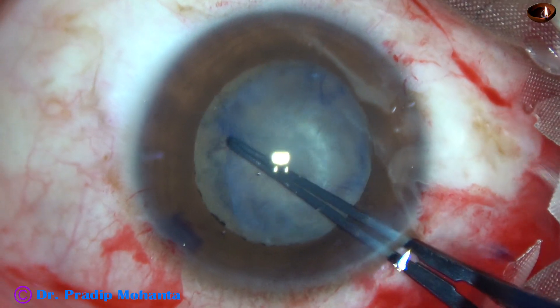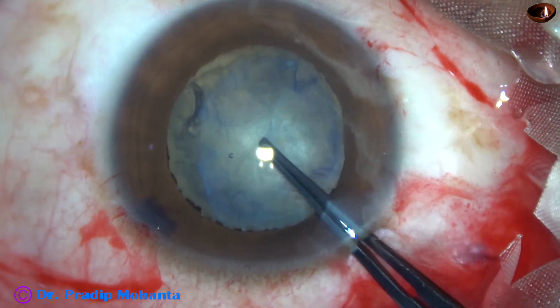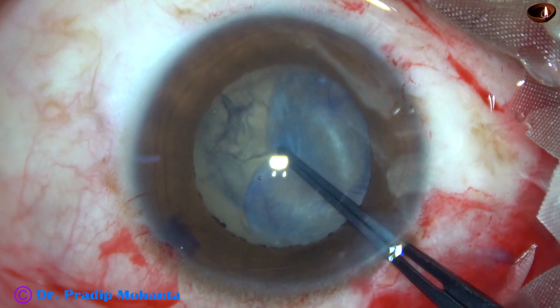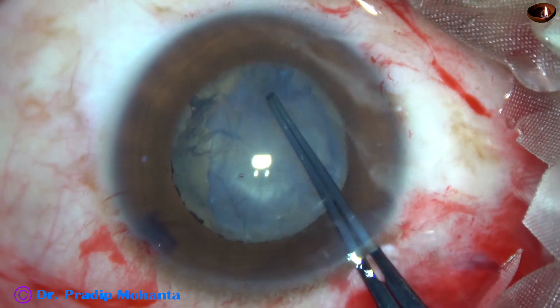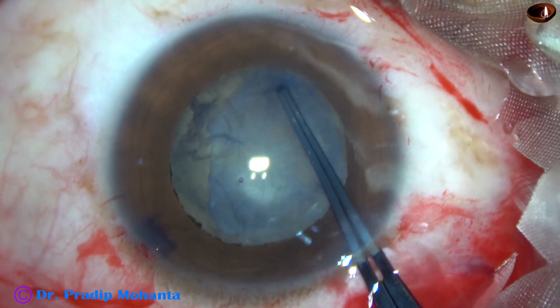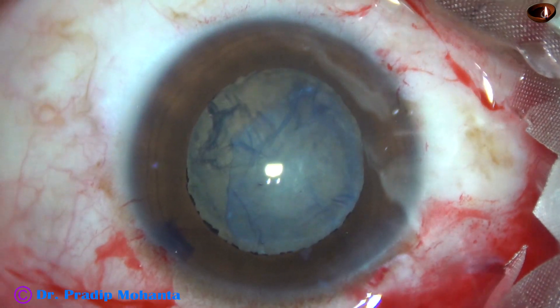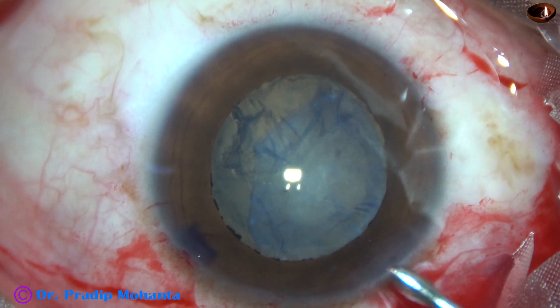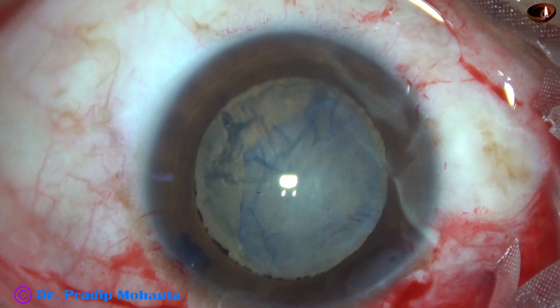Here I could go beyond the edge and bring it here, and again dissecting the anterior capsule from the fibrous sheet. Again dissecting the anterior capsule from the fibrous sheet, and it has come to the center.